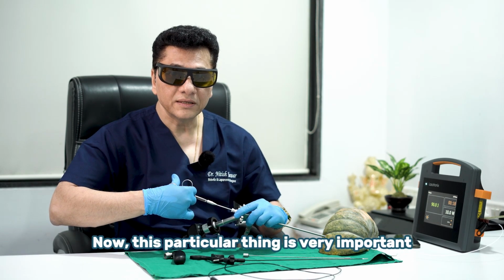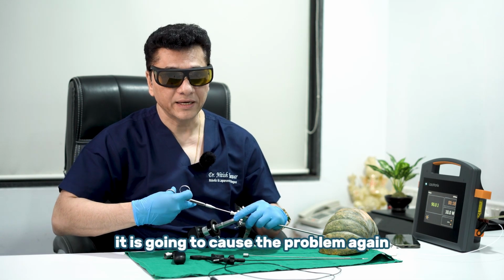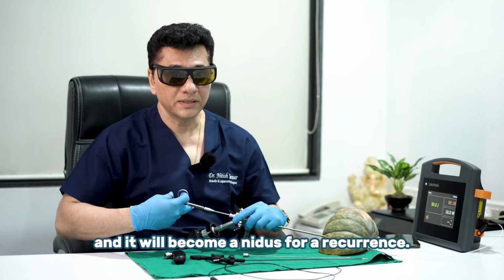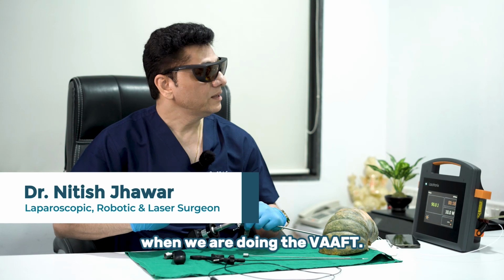Now, this particular thing is very important because if you leave the debris inside, it is going to cause the problem again and it will become a nidus for a recurrence. So, this fistula brush is a very important instrument when we are doing a VAAFT.